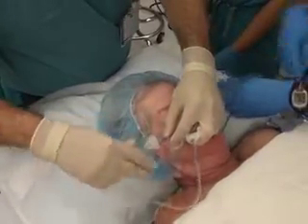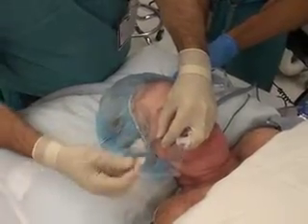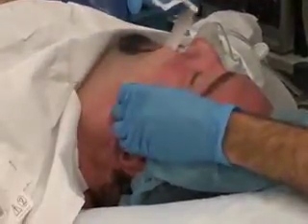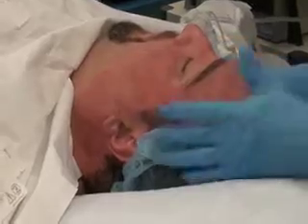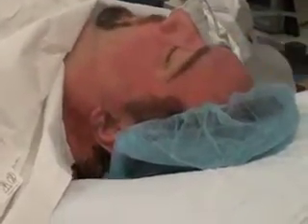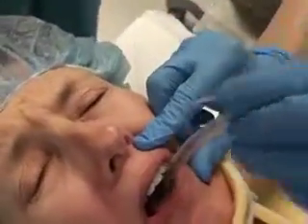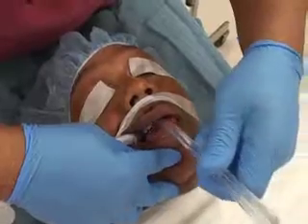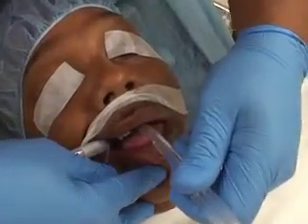Suction the patient's endotracheal tube using a disposable catheter or an inline suction device, and then carefully remove any tape or securing device in preparation for extubation. Avoid inducing abrupt head and neck movements, which may cause the endotracheal tube to stimulate the trachea and trigger coughing. A patient with an injury to the cervical spine may require additional neck support. Carefully suction any oropharyngeal secretions, avoiding direct dental or airway trauma.